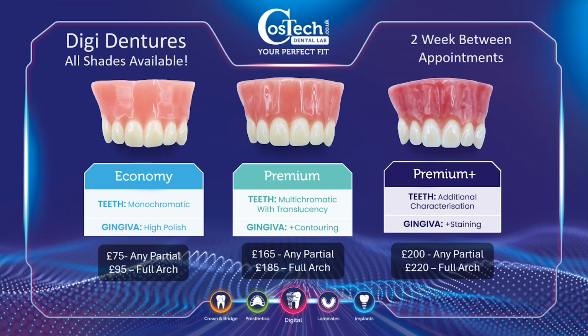So the first one we have is NHS. This uses the basic library. We have set libraries on the Exocad that we can pull in, and it's the same as when we have the tray of teeth that we use in the lab, and we choose the mold which fits the teeth as closely as we can. With the contouring, it's just on the gingiva, it's just basic, just smooth. It's a functional denture, and we just highly polish it.